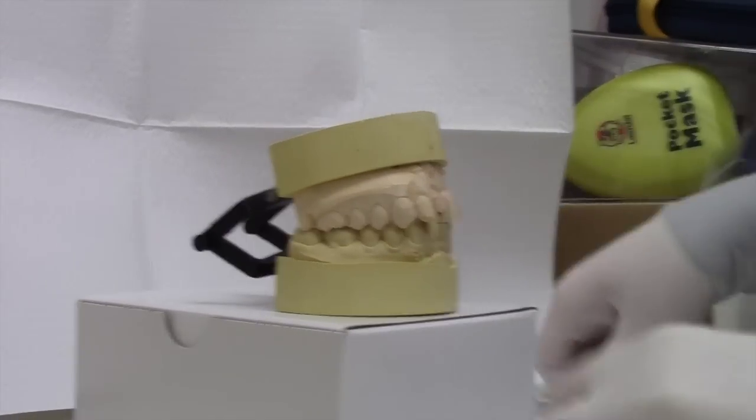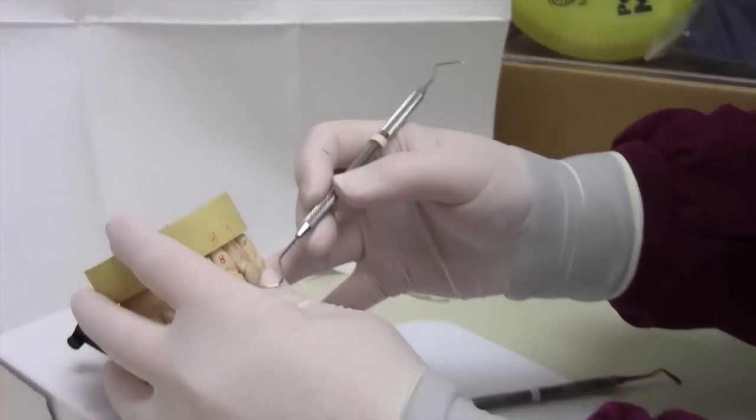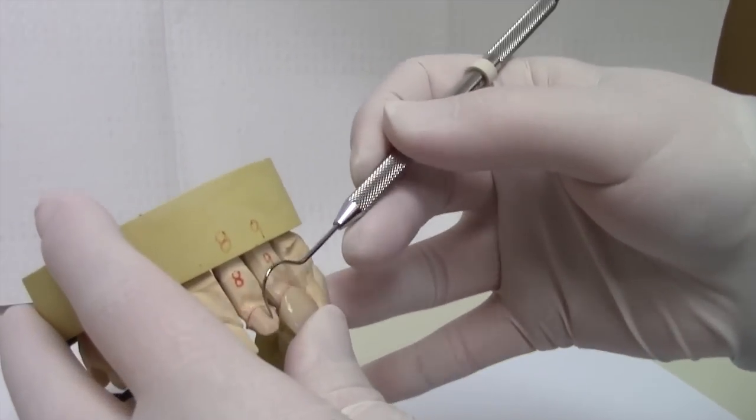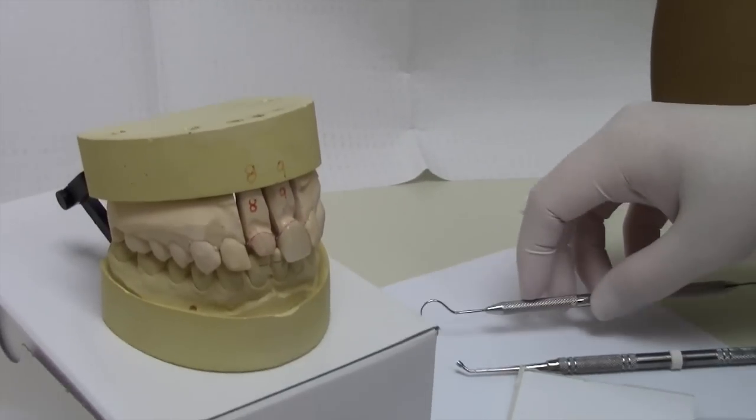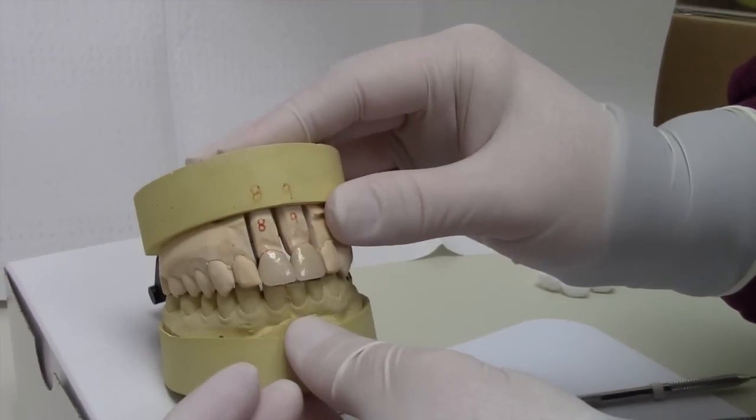First, you must clean the dry cement out of the temporary crown and off of the tooth. Try the temporary crown on, making sure it feels normal.